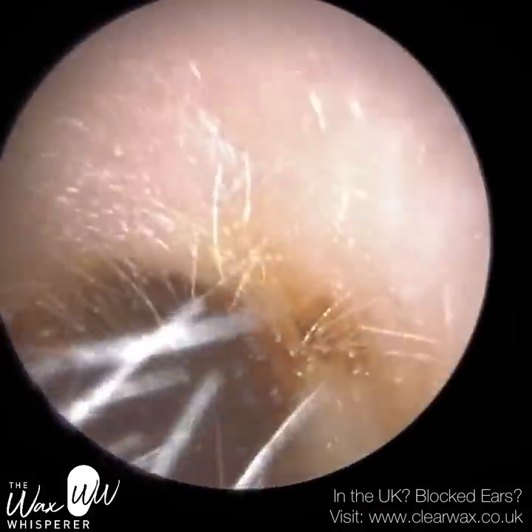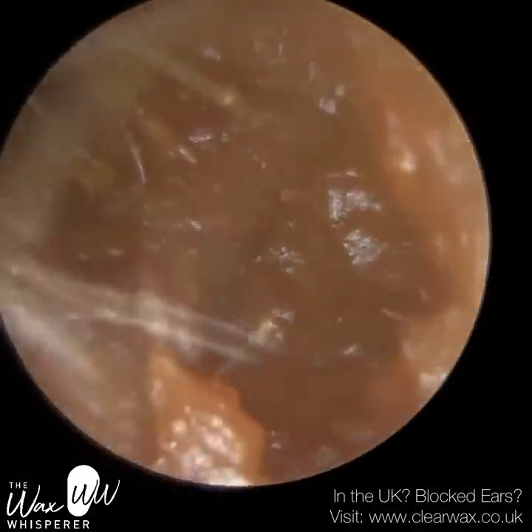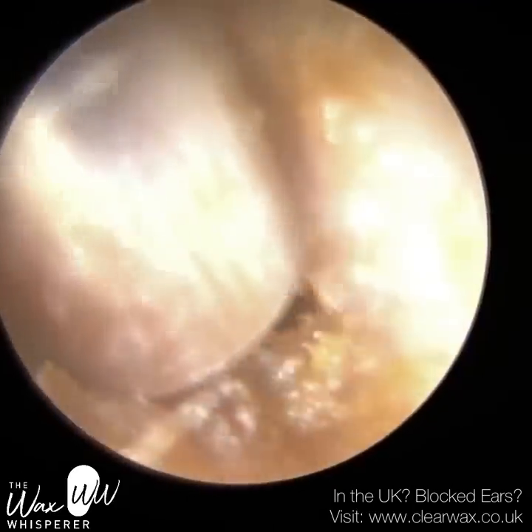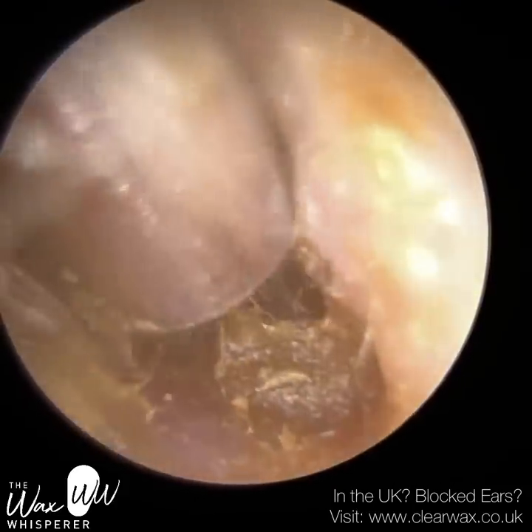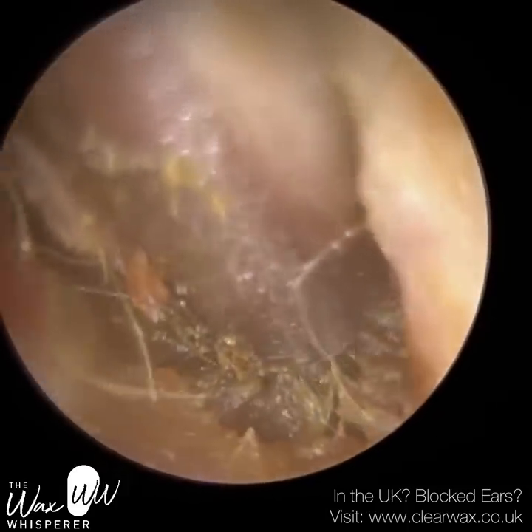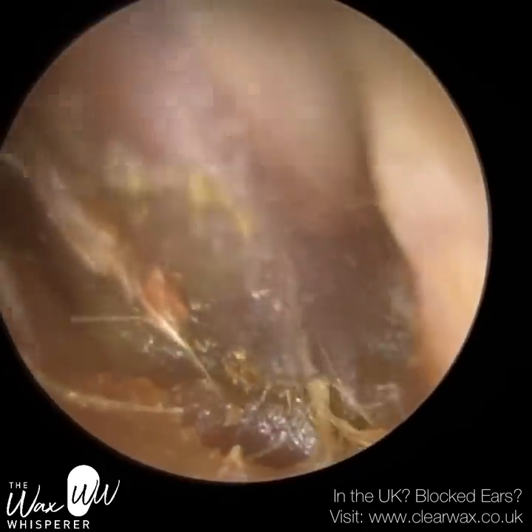In this video, I have a couple of patients. This is patient 1, who attended with a blocked right ear. This patient had really soft, wet, loose, medially impacted wax. When we say medially, we mean towards the eardrum, so it's deeper within the ear canal.